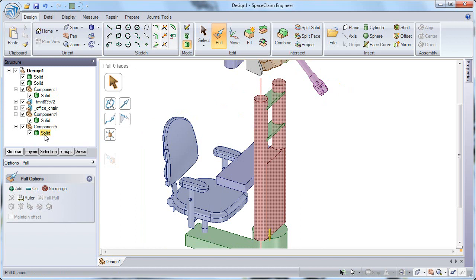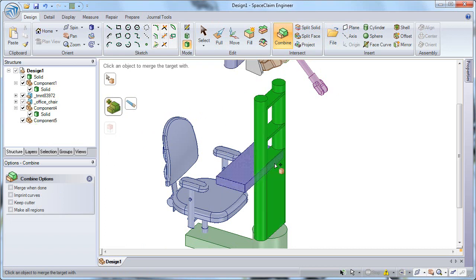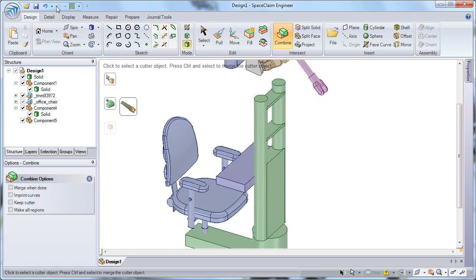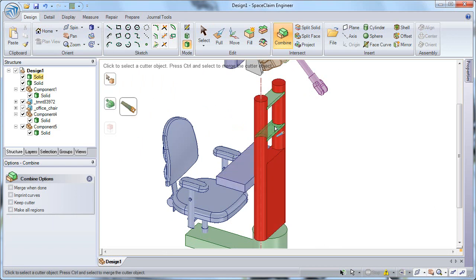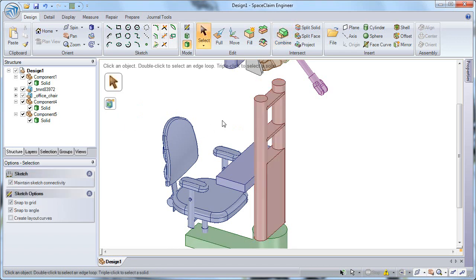And I want to merge that with my mount, or my tower. So using the Combine tool, I can select on one component, again hold down Control to toggle to the Merge feature of Combine, and then Control select the other two solids, and I get one solid in my structure tree. Now that solid was represented at the top level because I selected one of my supports first. But I can undo that very easily and instead select on my mount first to specify that as the base component that I'd like to merge the other two. So now I'll hold down Control, select my two support brackets, and you notice that those are now merged into the solid within the tower component in the structure tree.